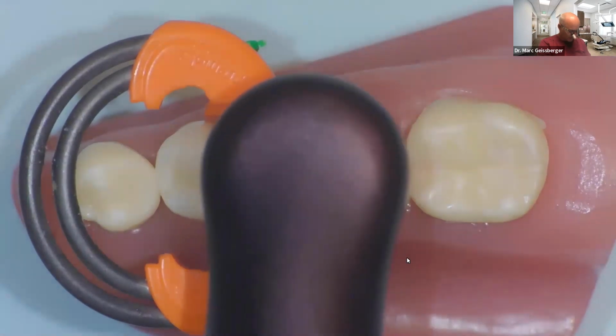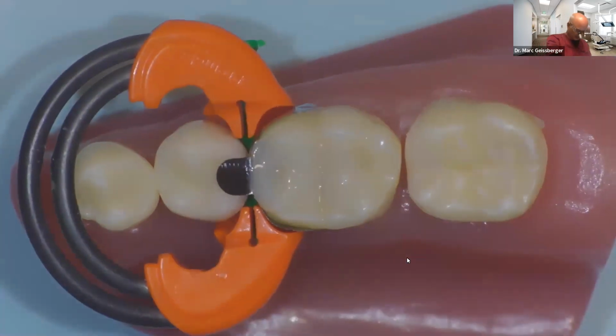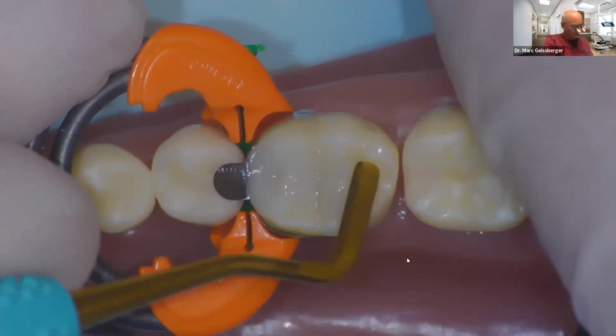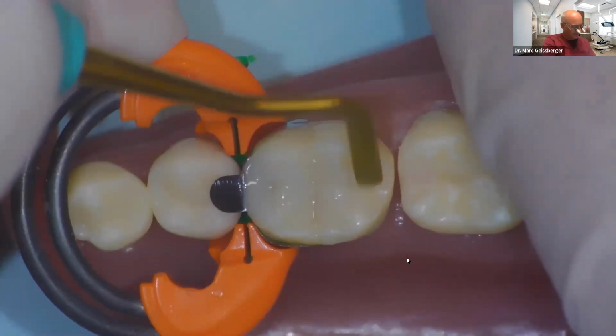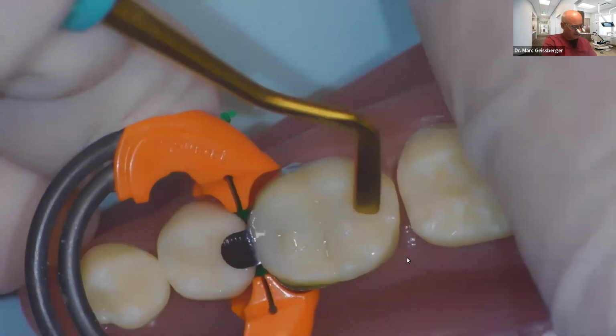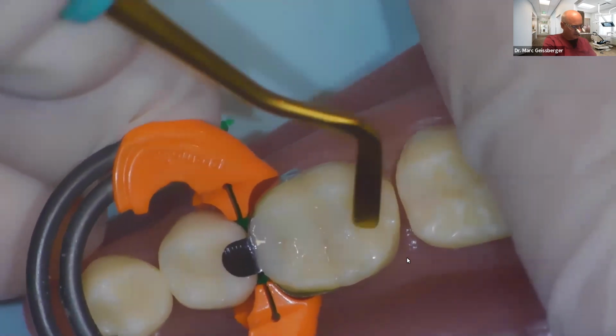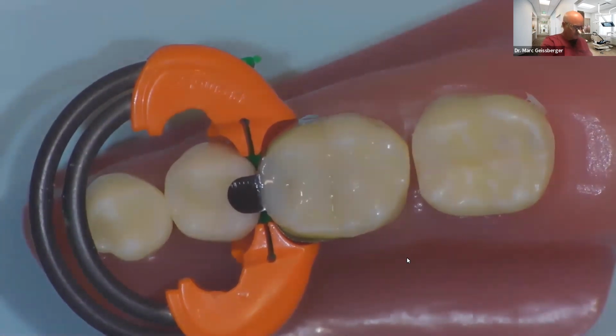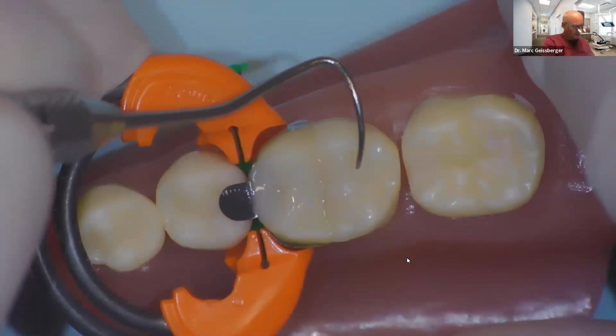And I have one bit of composite left to place on this restoration. So we'll be done here in just a minute. Okay, so I'm going to place that now, and it's a tiny amount. I'm going to remove my matrix band and show you what we got. Okay, so we're doing super, super well. Now it's a little tiny distal cusp. Doesn't need a lot of composite. Got that all filled. Come in here, get my anatomy.